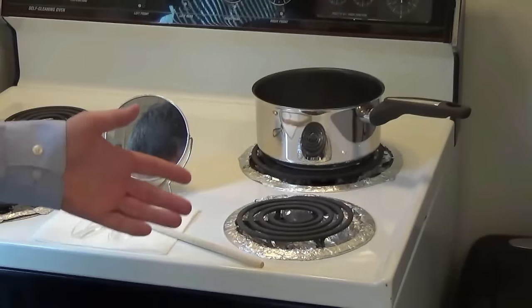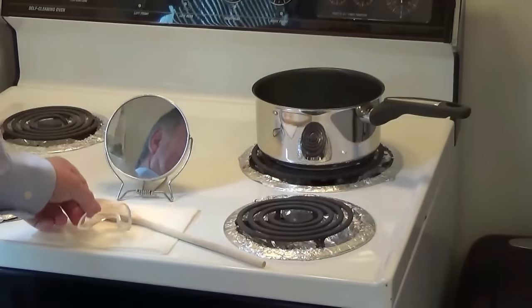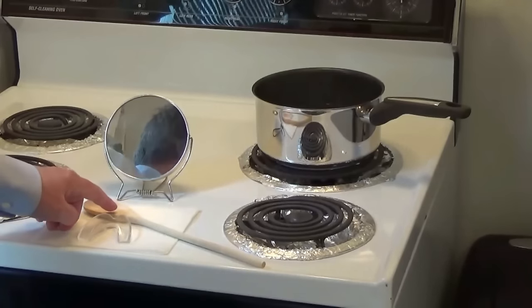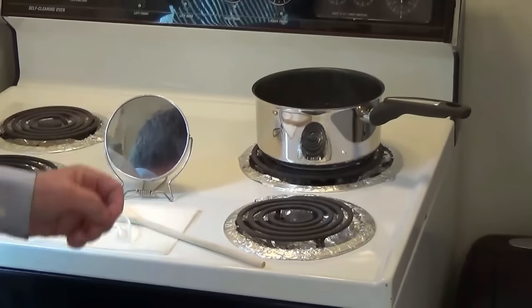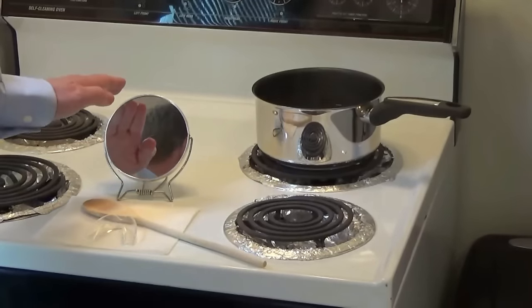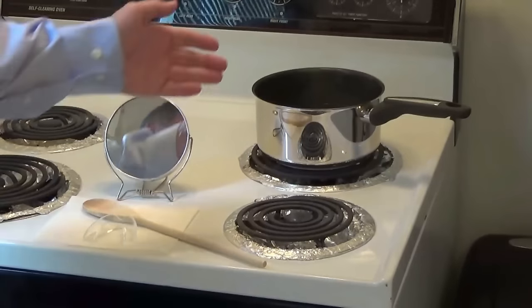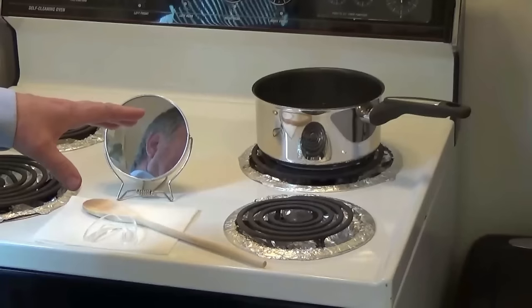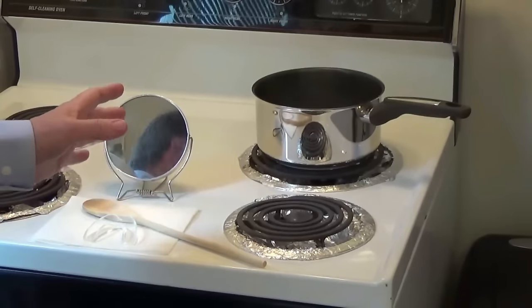Let's head out to my kitchen and do an actual demonstration. I have the tools that I need: I've got the mold itself, a paper towel, and I use a wooden spoon. If you're going to use a metal spoon, you should have that in ice water so that the mold doesn't stick to the spoon. I've got a mirror to see what I'm doing, and then I also have rolling water already heated and ready to go.